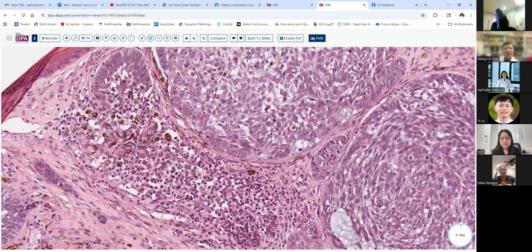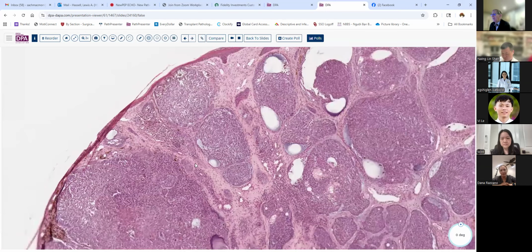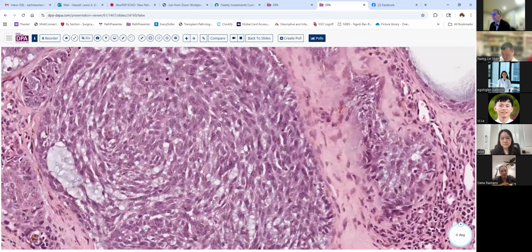So clinically, this was pigmented and sort of nodular, and so there was some concern that this could be a melanoma. So that, from a clinical standpoint, comes into play here. And then, when you look at this lesion, it's got a bit of a spindle cell pattern and some sort of mucoid or myxoid stuff in between. Some melanomas can have this kind of myxoid appearance, they can be spindle cell pattern and so forth.